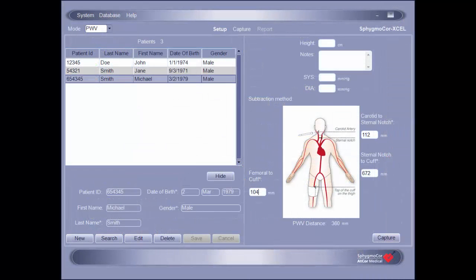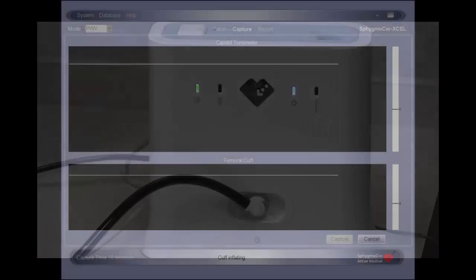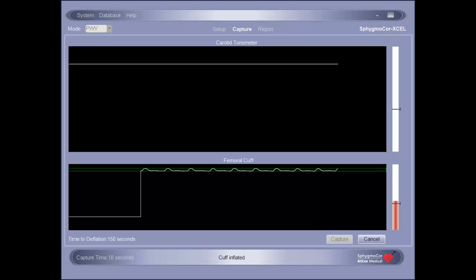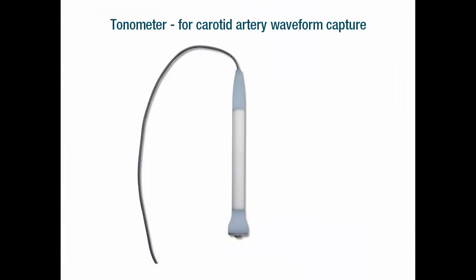Once the capture button has been pressed, there will be an audible click as the pump turns on and begins inflating the cuff. At the same time, the software will transition to the capture screen. When the pressure in the thigh cuff reaches the desired level, it will discontinue inflating and start acquiring the waveforms in the femoral artery.